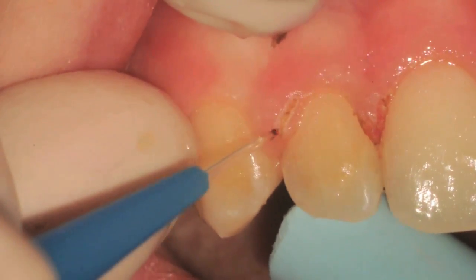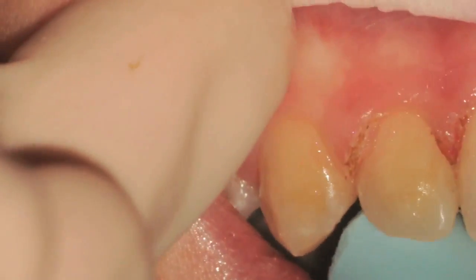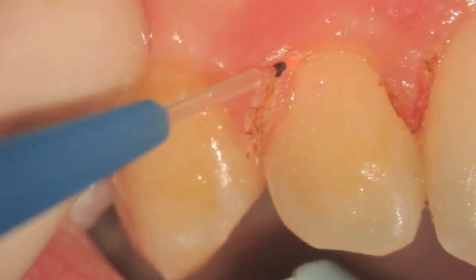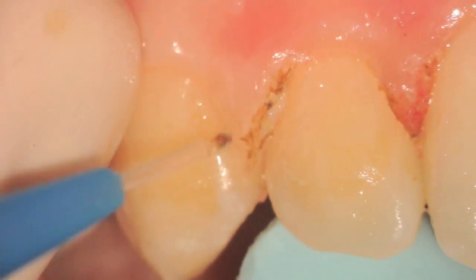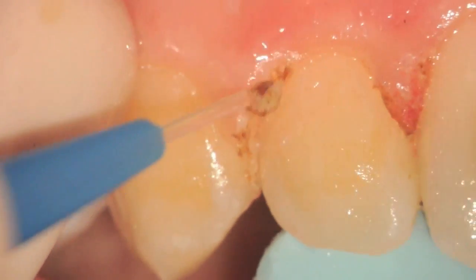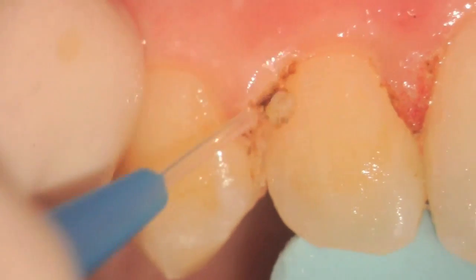The nice thing about the Picastrolite tips is they can really be used almost like a pen to brush away the tissue. You can see this view at higher mag as we're trying to remove the enlarged papilla, which was partly due to poor hygiene during orthodontics and also due to the teeth being brought together with C-chain, causing the tissue to bunch up in between.